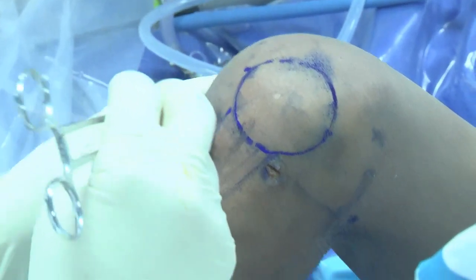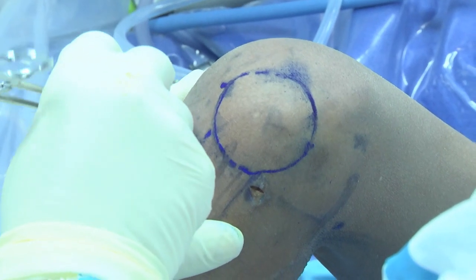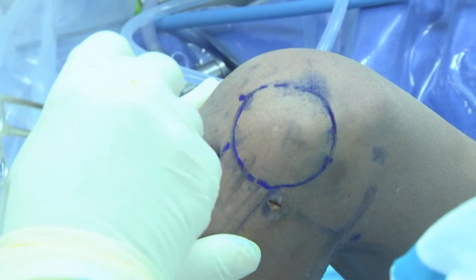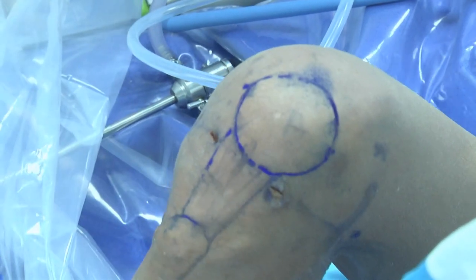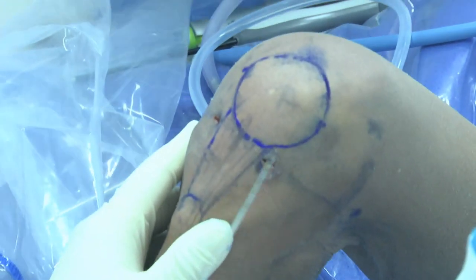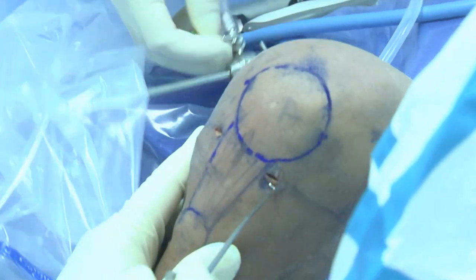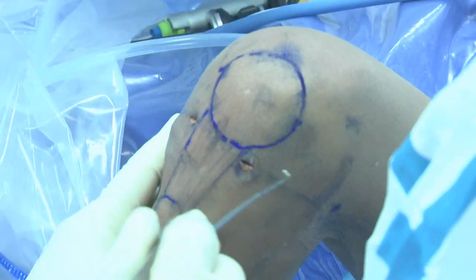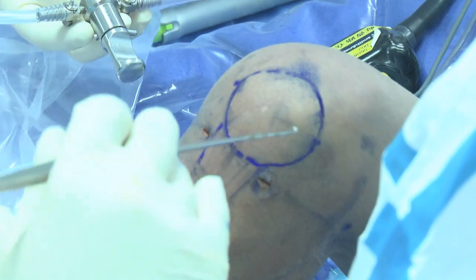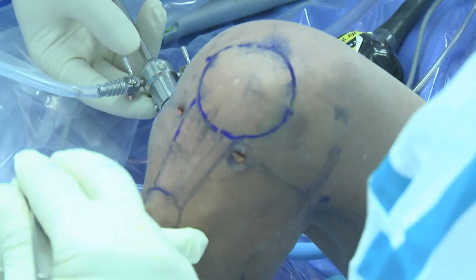On my medial side, I never use the needle to identify, but this is really accurate, okay? I make it like this, across the patella tendon. Medial and lateral, okay? The knife goes transverse first, just on the skin, okay? Swing it, rotate it clockwise and counterclockwise, so the tract is rounder and won't be a line. The benefit of this transverse incision is number one, it's safe to your meniscus. When you put in too deep, it's also parallel to the meniscus. You don't cut the meniscus. Number two is when you go in the joint, you move this way, right?